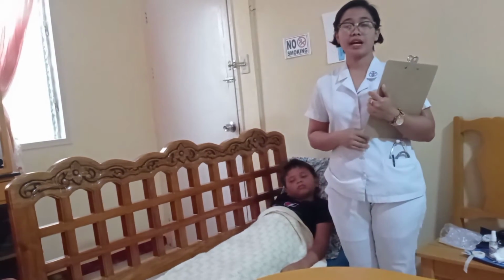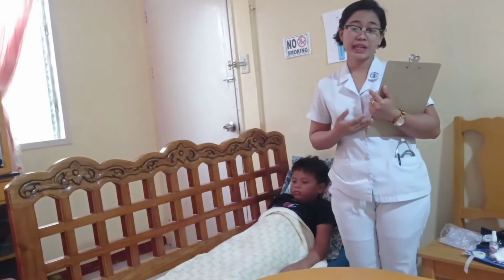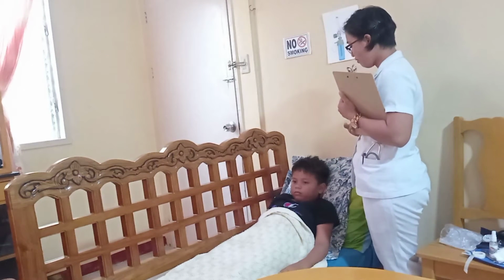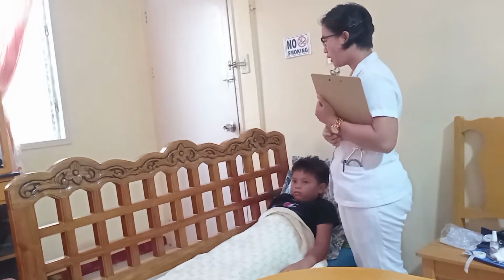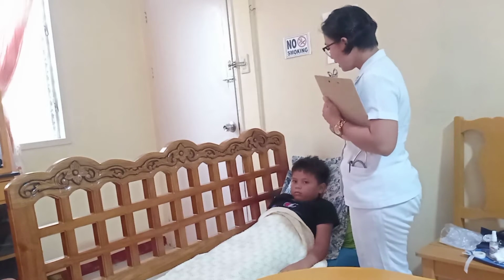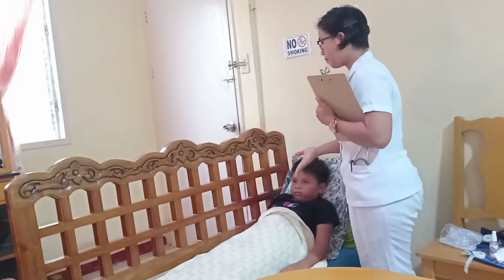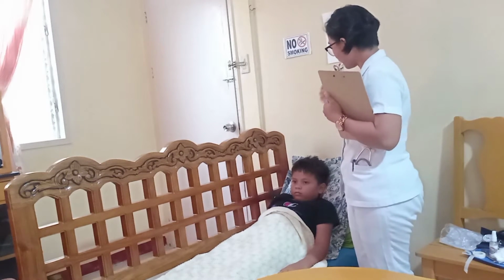Also, by discussing how the effects of oxygen therapy will be used in planning for further care or treatments. The rationale for this is that oxygen therapy is generally safe, though there are some side effects. Also, sir, I would like to inform you that oxygen therapy has a tank inside that is a combustible material, which I would also like to remind you and your mother of: our oxygen tank is combustible.